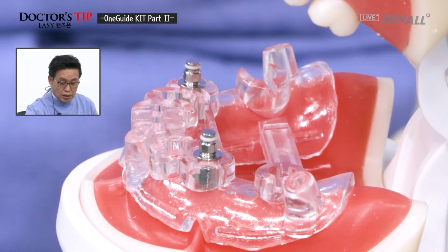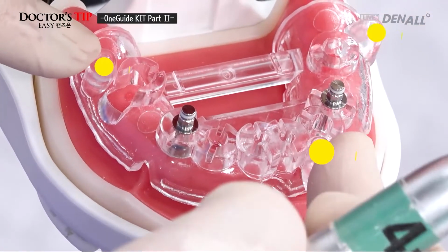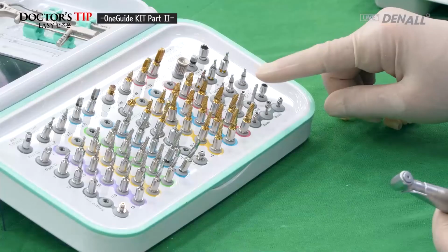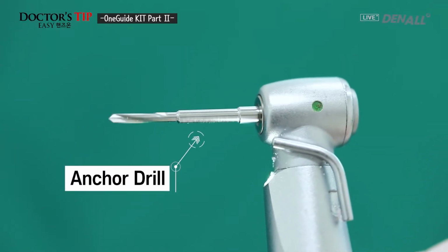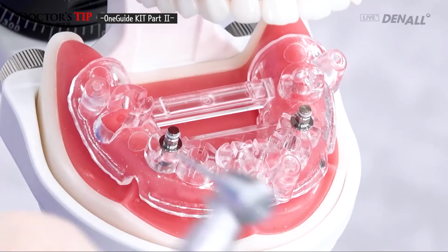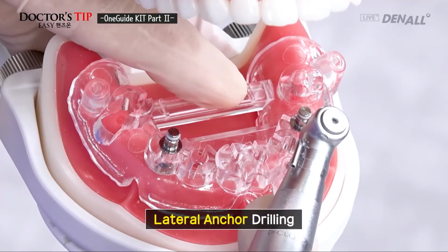After that, because it's a fully edentulous case, as supplementary measure, lateral anchor is going to be used. 3 anchor holes have been prepared. I'm going to connect anchor drill. There are 3 sites for lateral anchor.